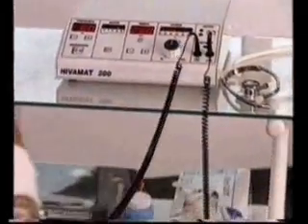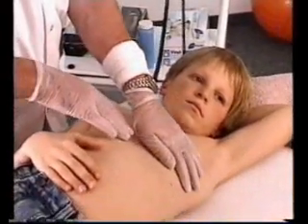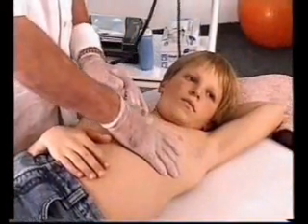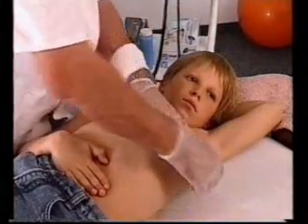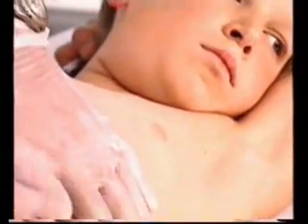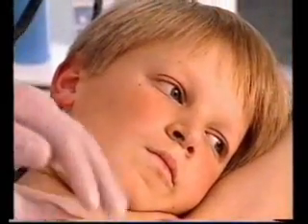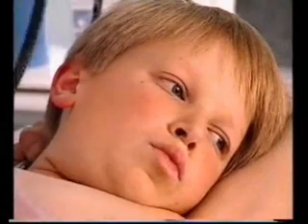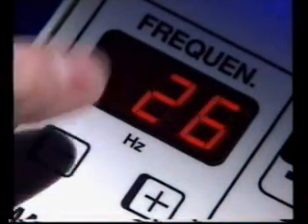Deep oscillation is applied as treatment for respiratory tract diseases with great success. The resonant vibration very quickly results in an effective detonization of the respiratory muscles, which may be observed by an increase in the tidal volume during treatment. Additionally, the resonant vibration contributes to loosening sputum. By varying frequency, the resonant vibration may be adapted to the individual patient's conditions.